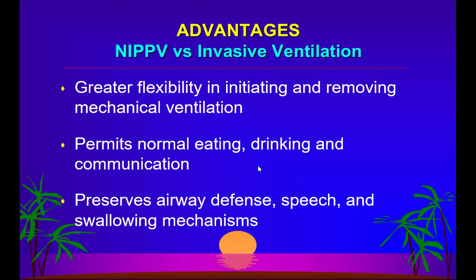One thing is very important: when the mask is on, please do not do it, because there is very high risk of aspiration. Or if the patient is speaking, then it can cause air leak, and this can cause discomfort and inadequate ventilation. So if somebody is to eat, drink or talk, it is very important that you remove the mask, remove the ventilator, and then you can allow him to do those things.